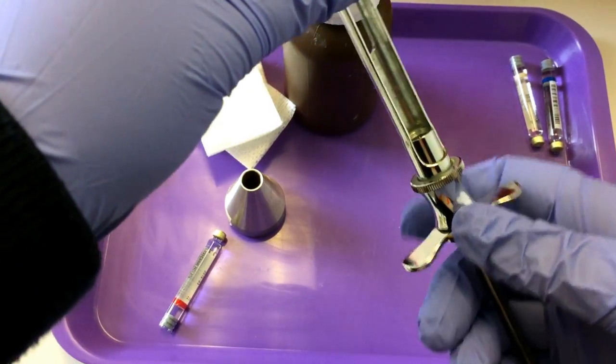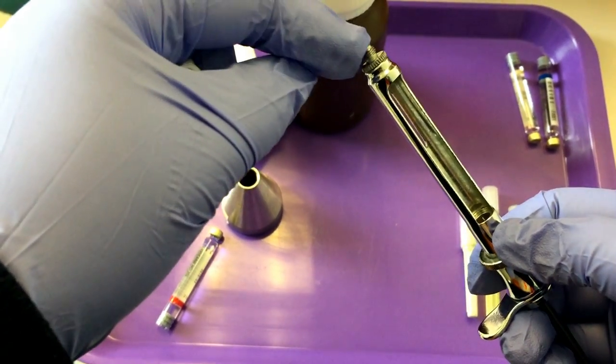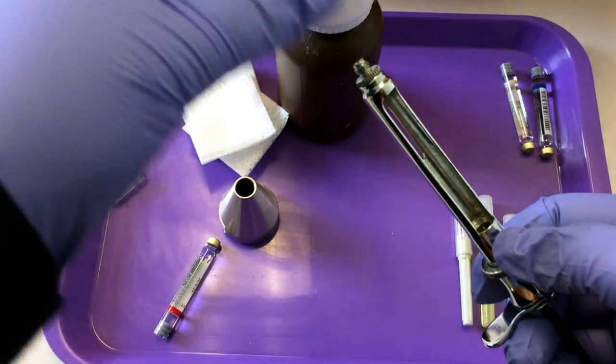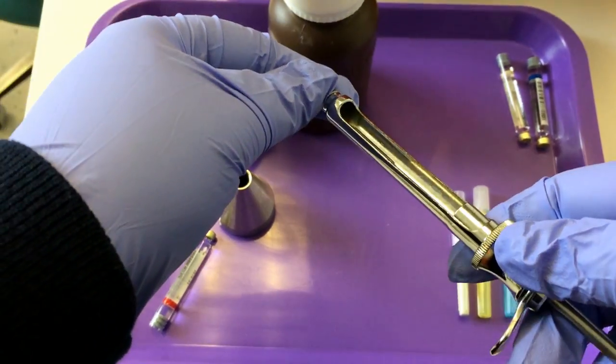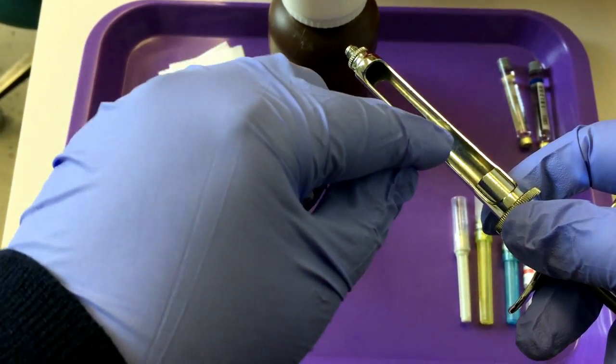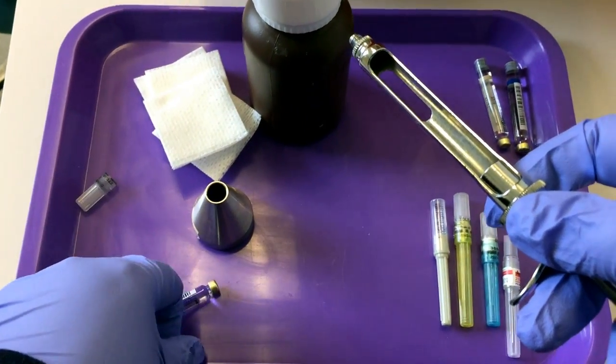Before we can insert the carpule, we want to attach the needle first. I prefer doing it this way. This is how I teach my students, because if you put the needle on first, you can make sure that the stylus is straight and not bent. If you have a bent stylus, it won't be able to puncture the carpule.